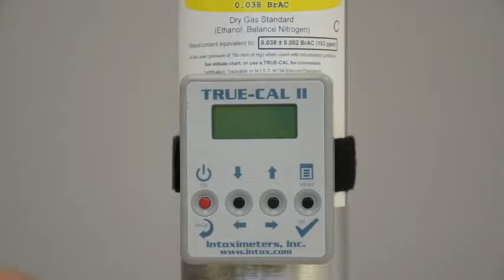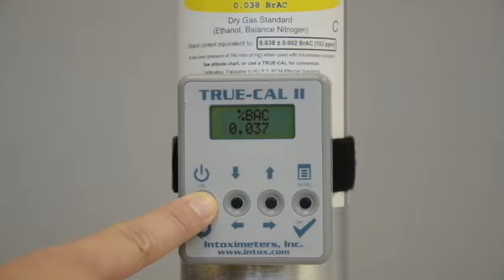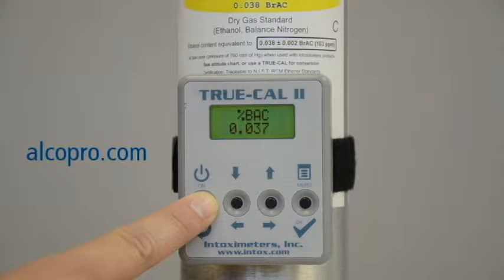You can also derive the expected value by using a TRUE-CAL device, which uses atmospheric pressure to predict the expected value of the gas. You can purchase a TRUE-CAL device at alcopro.com.